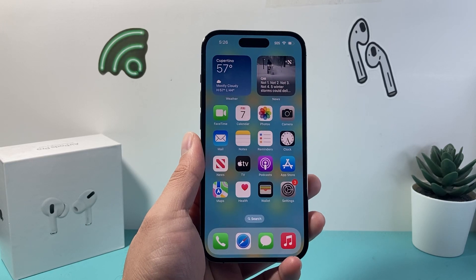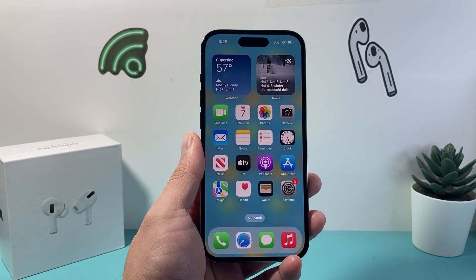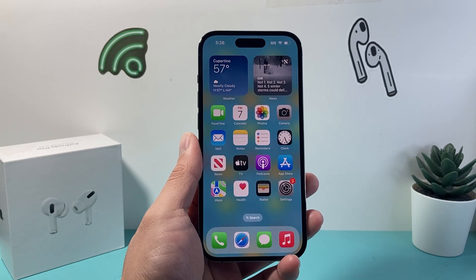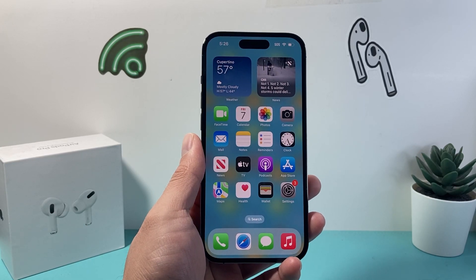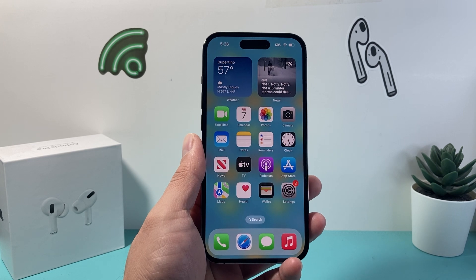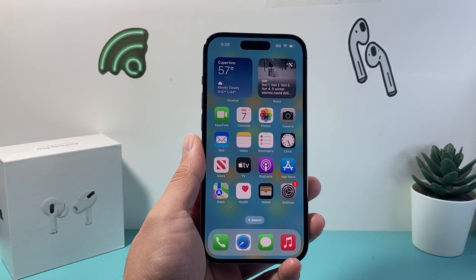Hey everyone, Forrest Reestar here. In today's video I'm going to show you how to download and install the Dexcom G7 app on your iPhone.